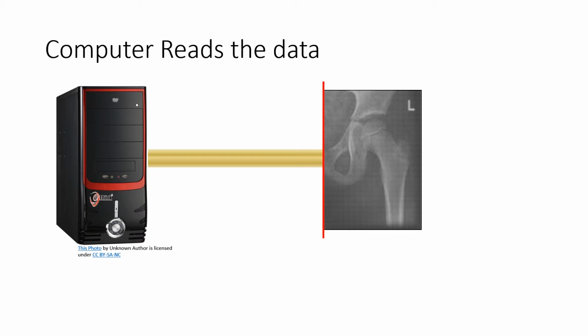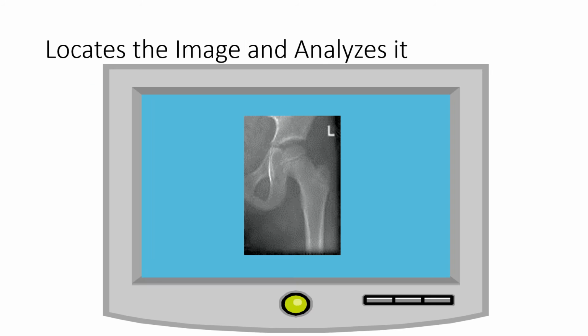Once the imaging plate has captured the anatomy, the computer reads the plate, the computer then uses the collimator borders to find the image, and then uses these borders to generate a histogram of the image. This histogram will be used later to correct the image before display.